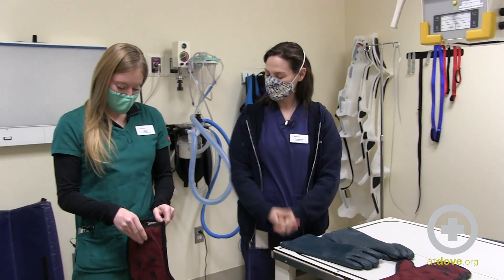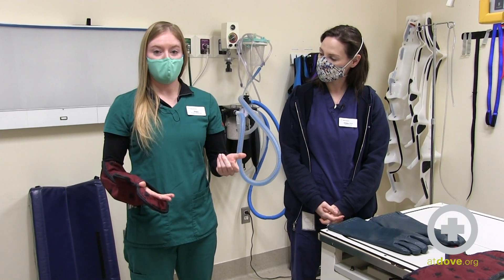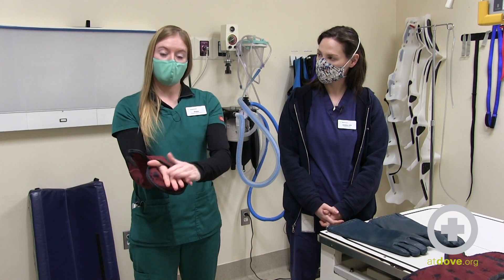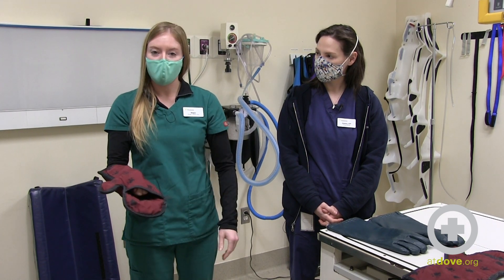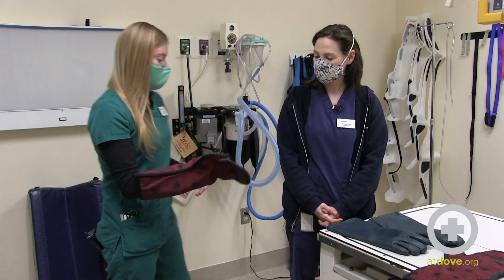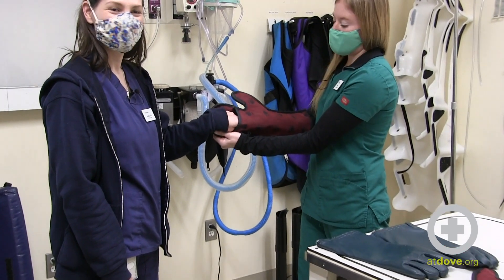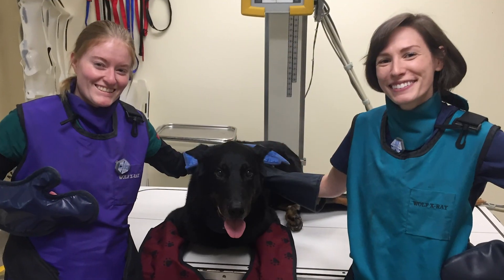There's a trick I've learned when working with mitten-type gloves, since we often need a good grip on patients' limbs to get a good radiograph. It's easiest to first grab hold of the patient's limb with your hand outside the glove, then as you're holding that paw, pull your hand — and maybe a little bit of the patient's paw depending on the radiograph — into the glove. I can actually pull the limb into my glove so her fingers are protected, my hand is completely protected, and then the image can be taken.